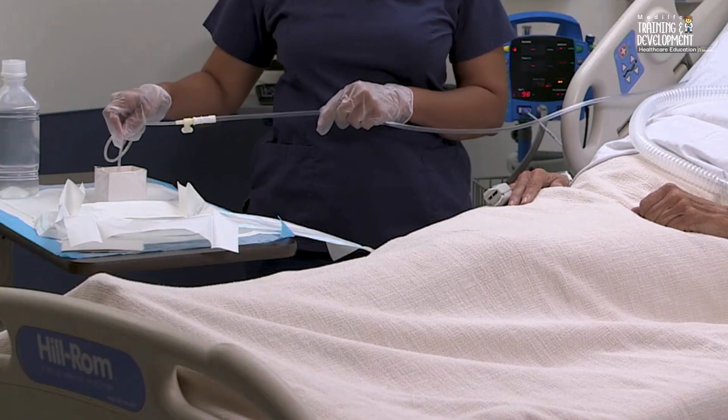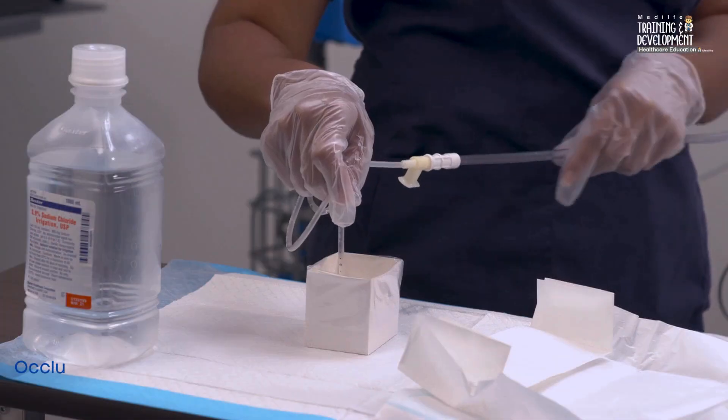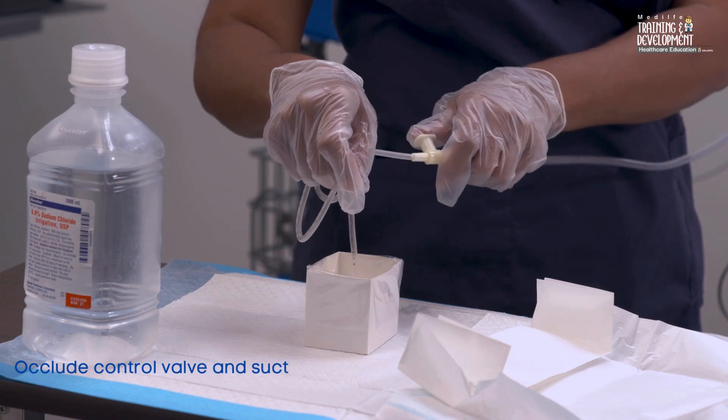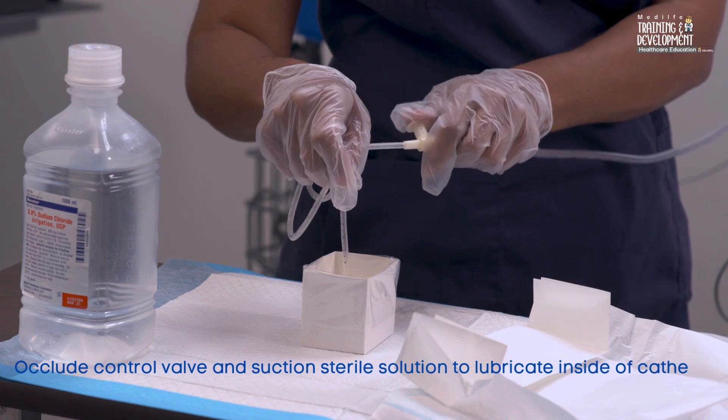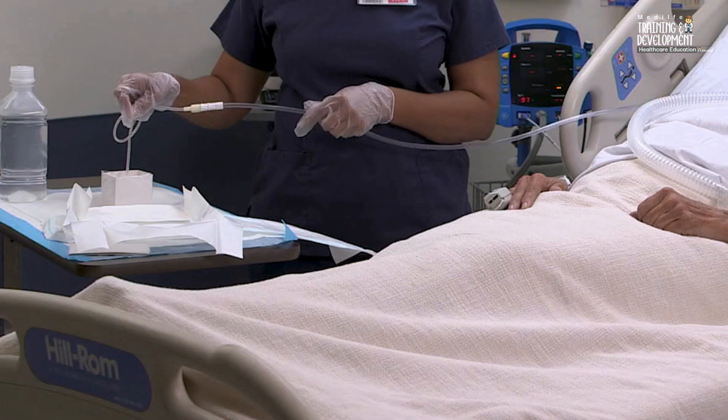With the suction catheter tip in the sterile solution, occlude the suction control valve with the thumb of your non-dominant hand. Suction a small amount of the solution through the catheter to lubricate the inside of the catheter.